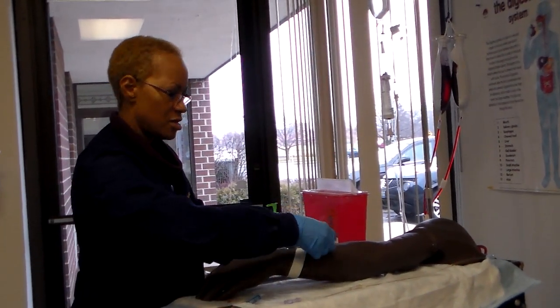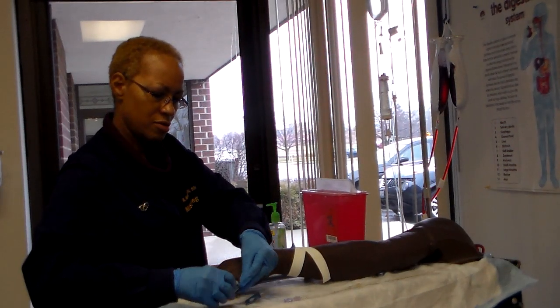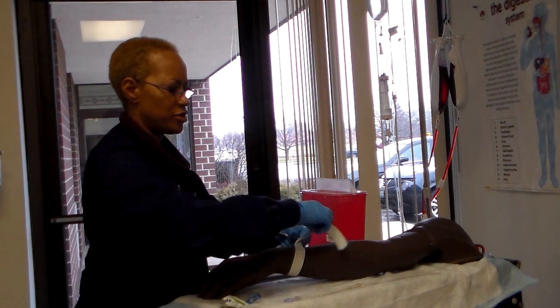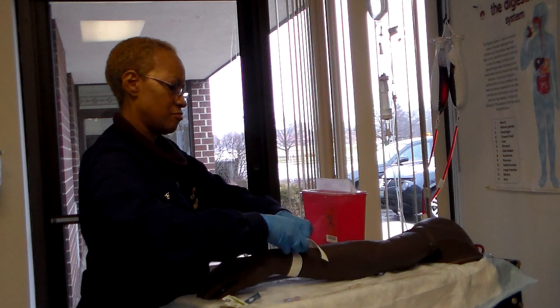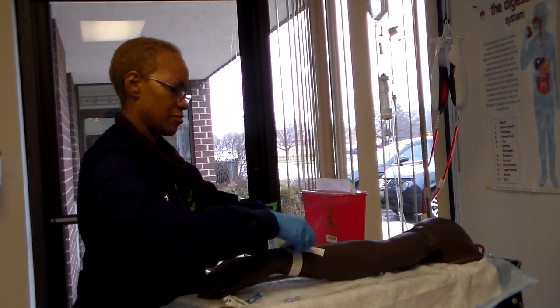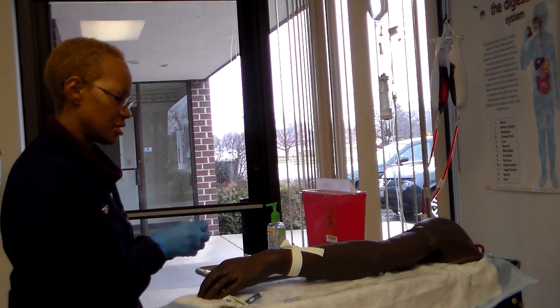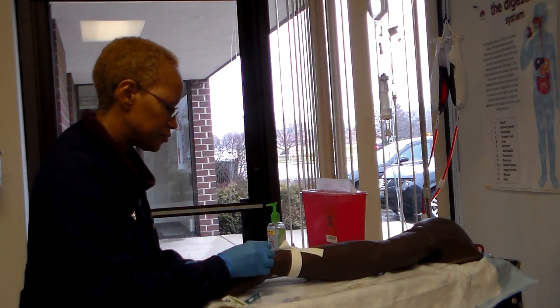So now I'm going to reapply my tourniquet. Remember, 4 to 6 inches. And in a way that you can just easily release it. Okay, now I'm going to clean my site.